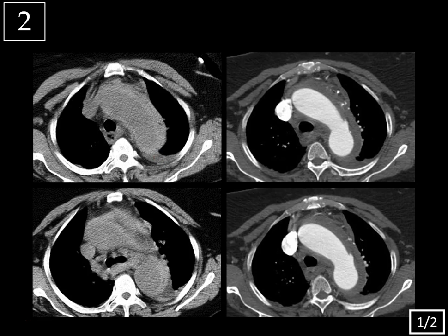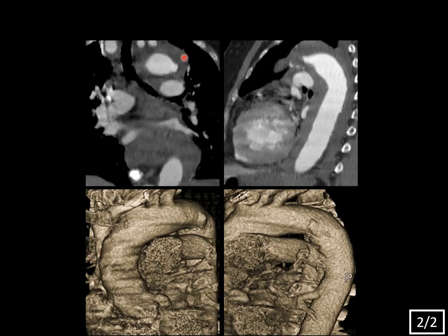So these left-hand images show a small left pleural effusion, as well as hyperdensity within the mediastinum, indicating a mediastinal hematoma. As you look at the aorta, you see this rind of hyperdensity within the wall, indicating blood or hemorrhage within the aortic wall, typical for an intramural hematoma. Intramural hematomas don't have an intimal tear — they're usually caused by ruptured vasa vasorum that bleed into the wall of the aorta. But we do see this little wide-mouthed ulcer-like projection extending into the intramural hematoma on these contrast-enhanced images, and if we look more closely on the coronal reformatted images, you see this ulcer-like projection filled with contrast, and also on the sagittal reformatted images and volume-rendered reformatted images protruding outside of the lumen.